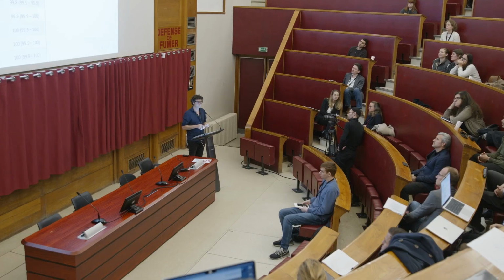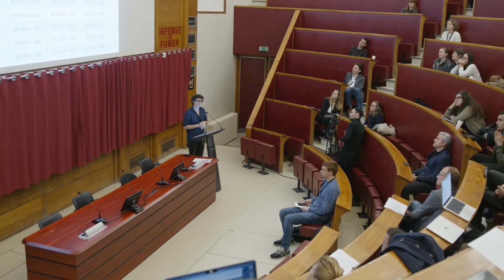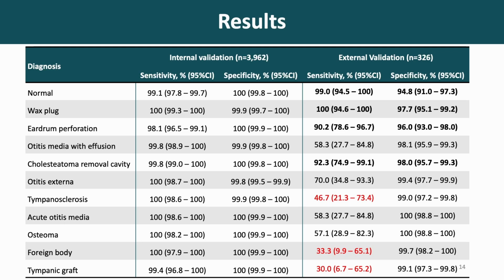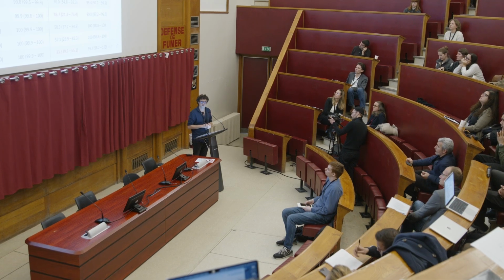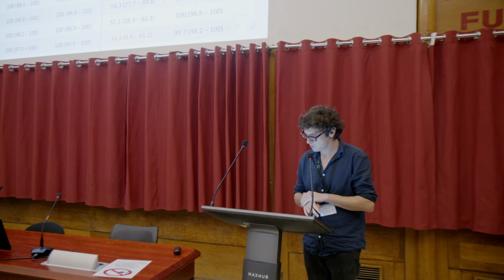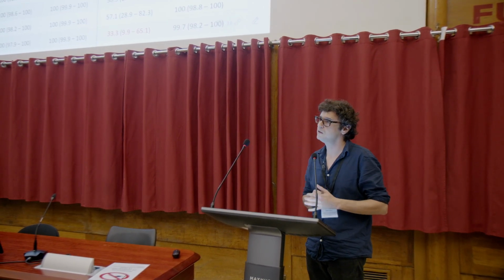But we had the luck and bad luck of having an external data set for validation. And here the performance went down. So specificity remained very high for all categories, but sensitivity was acceptable for some categories and very low for others, as low as around 30% for the presence of a foreign body in the ear, for example.